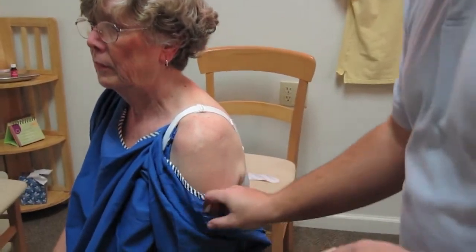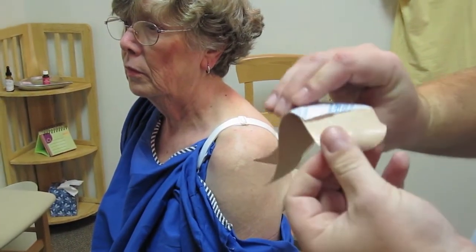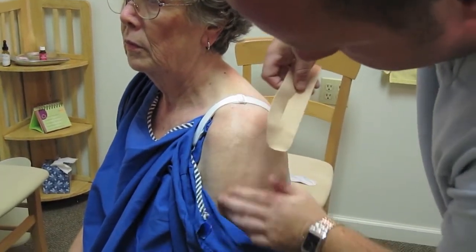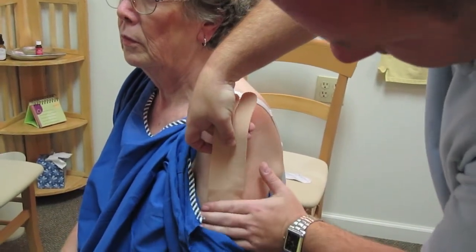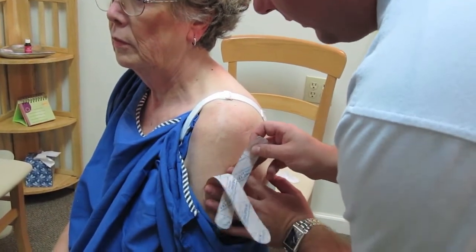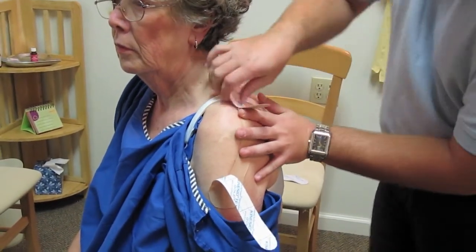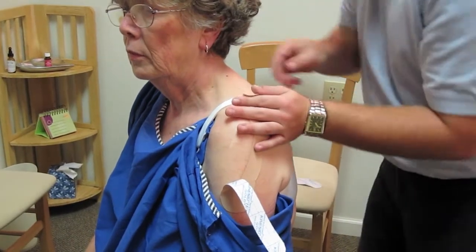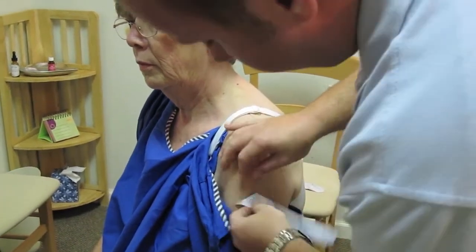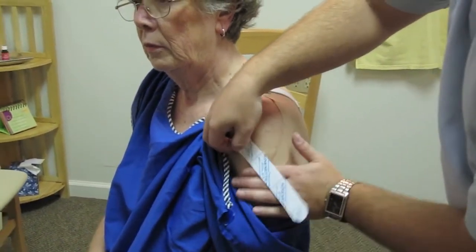The first thing I do is peel the back of the tape off on this one section right here. The tape itself has a glue which does most of the work. I find the muscle insertion, put the tape on that muscle insertion, and then peel off each section by itself. This is called the paper-off method. It helps with the tension of the muscle and is good for reducing edema, which is swelling, and for blood circulation and lymphatic flow.